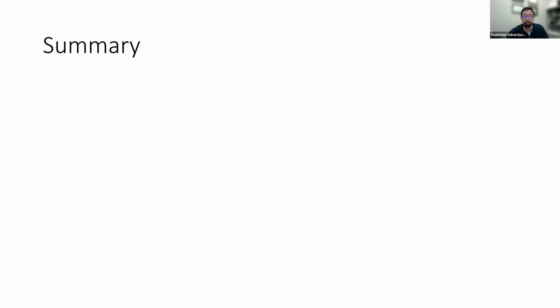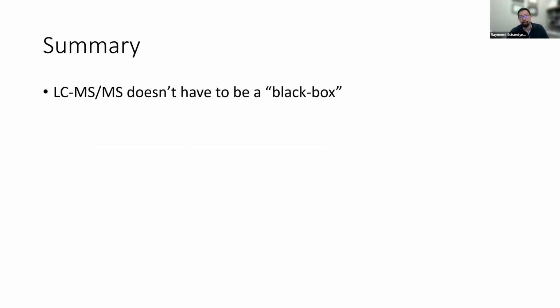So that brings us to our summary here. I hope that you can come away from this talk knowing a little bit more about what we mean by LC-MS/MS. LC-MS/MS really means tandem mass spectrometry. If you see the dash there, it's usually referring to triple quadrupole, but basically you're generating that transition. You're monitoring that fragment ion, so that way you get that extra layer of specificity.